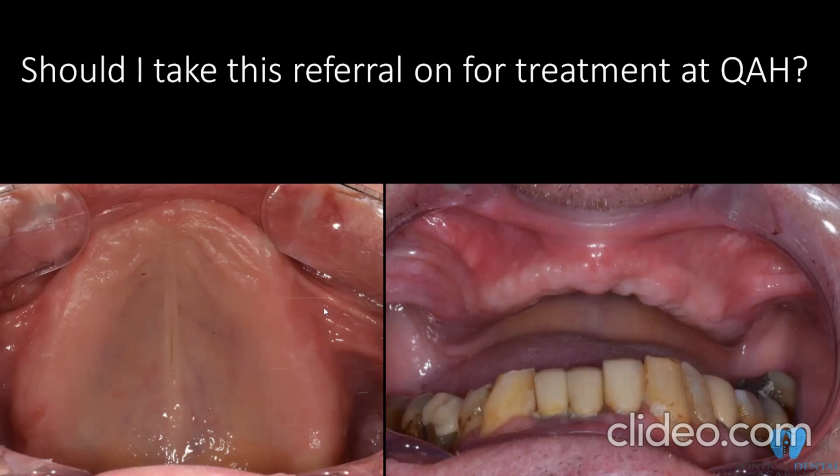A little bit of shallow sulcus near the buccal frenum. But again, from my point of view, I think this is a good size ridge, a good size surface for getting nice adhesion and nice fit for the dentures. Not necessarily excellent retention, but I think we can get reasonable stability, and that's what my colleagues and myself do on a daily basis at our unit.